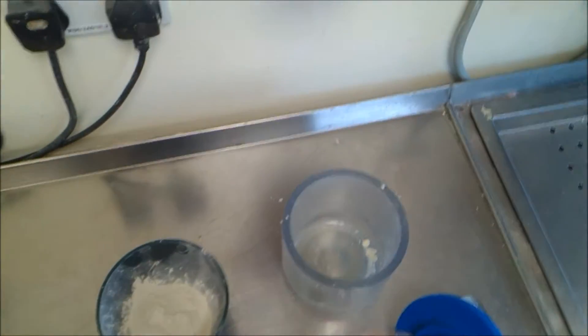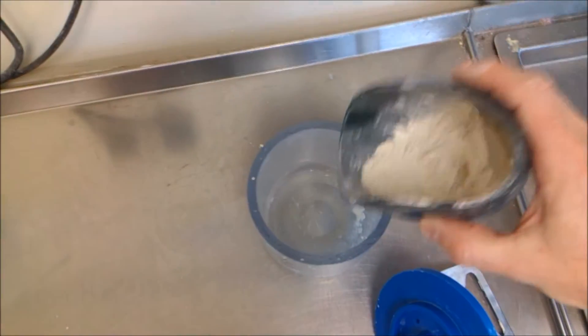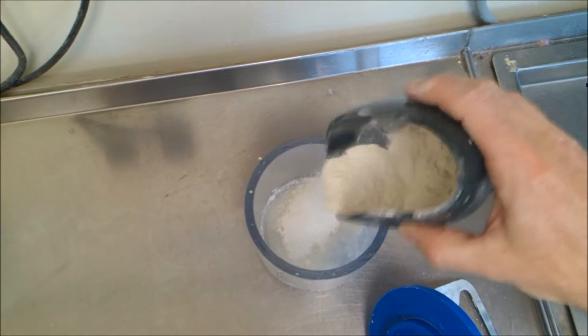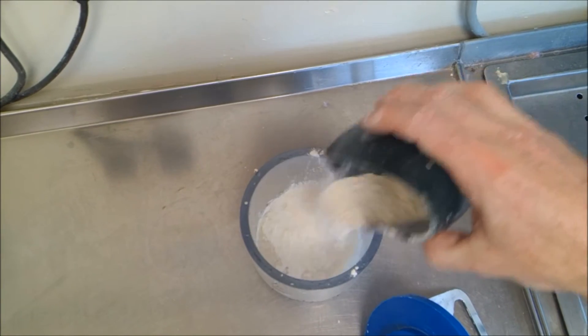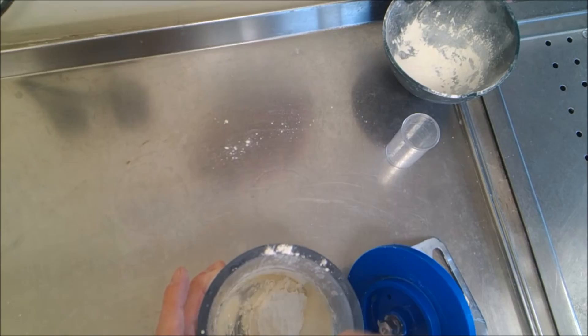We're going to add the 20 milliliters of water into the mixing vessel and sprinkle in the powder. The manufacturer recommends hand mixing for 30 seconds.